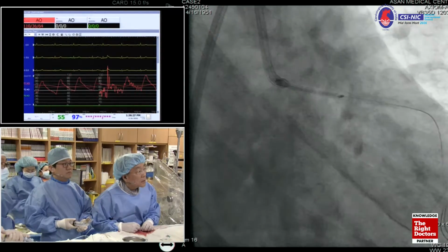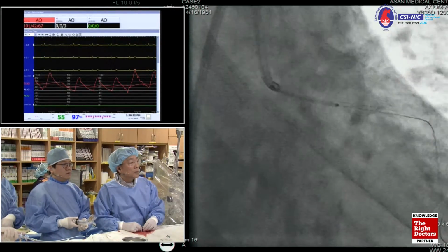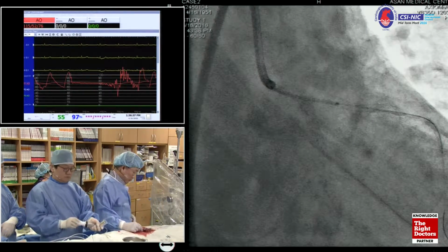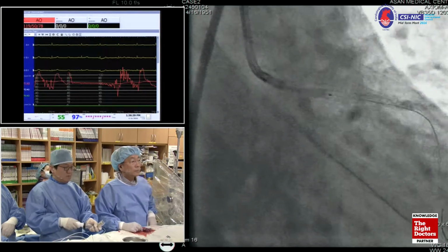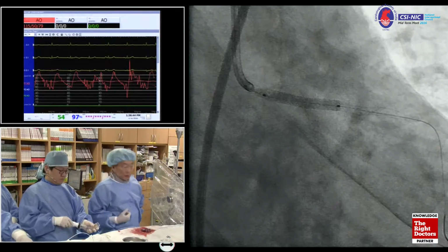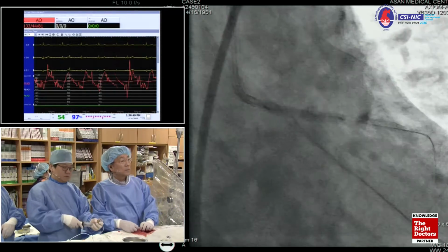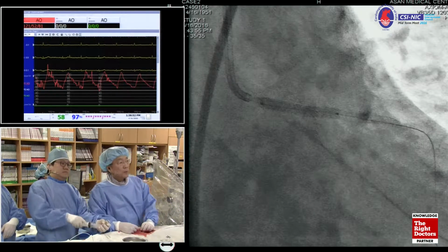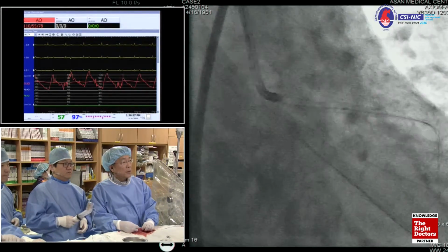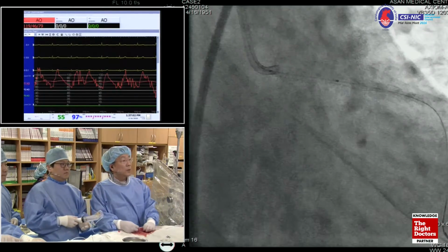All right. It's okay? Yes, okay. All right, so in order to cover the ostial part of the main, what do you think? It's okay? All right, why not? Inflate. So nominal pressure, 3.5. Okay, inflate further. 16. 16. What is the last balloon diameter? 3.75. Okay, patient feels chest pain, so we deflate and push the guider and pull the balloon out here, right?